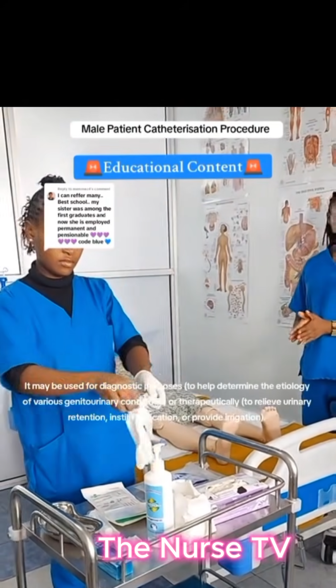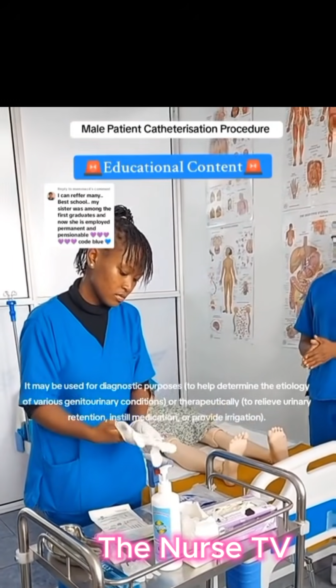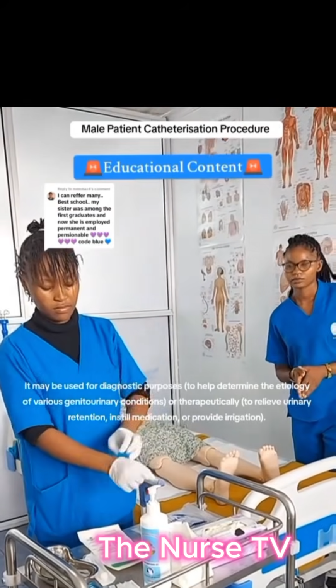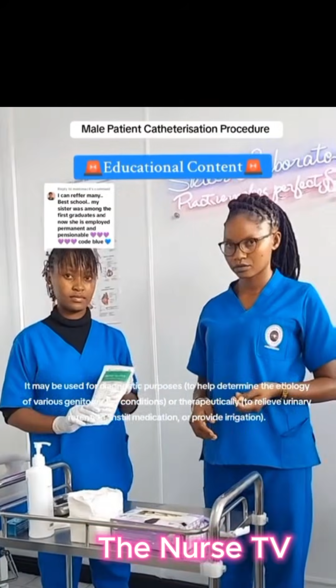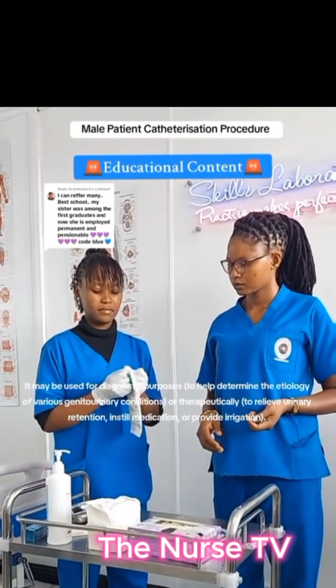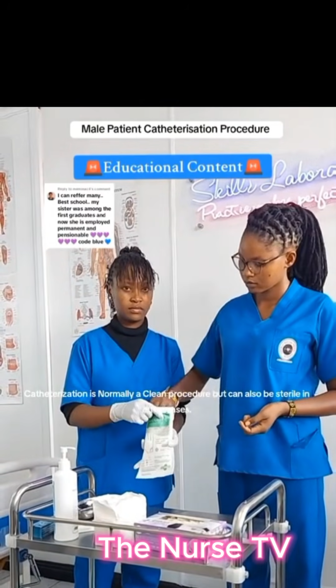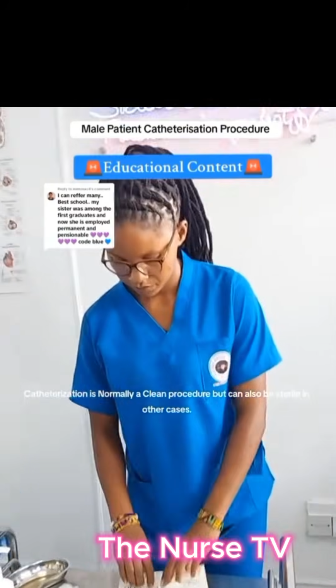It may be used for diagnostic purposes to help determine the etiology of various genitourinary conditions, or therapeutically to relieve urinary retention, instill medication, or provide irrigation. Catheterization is normally a clean procedure but can also be sterile in other cases.